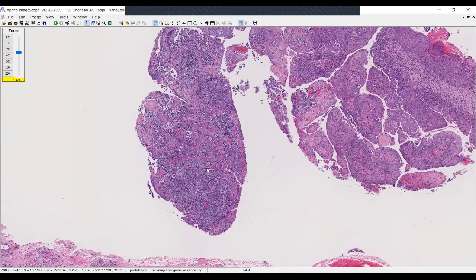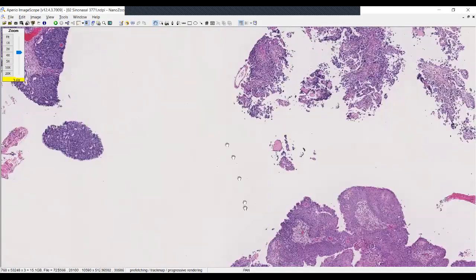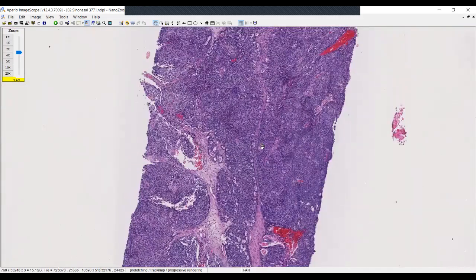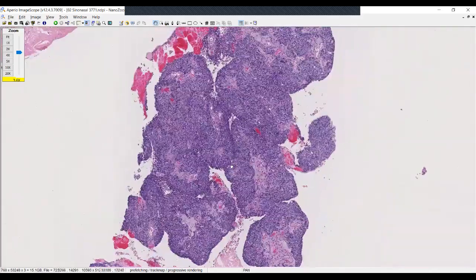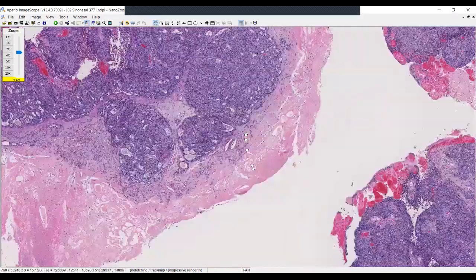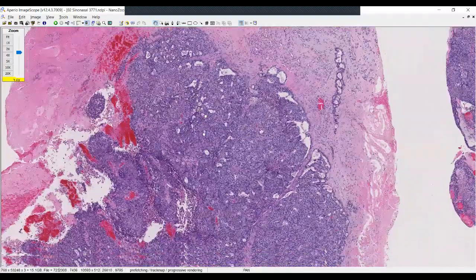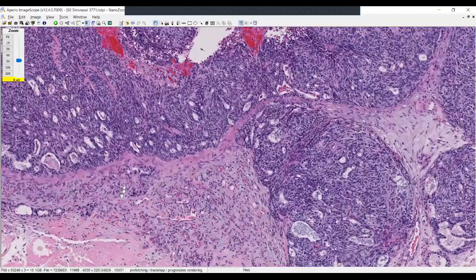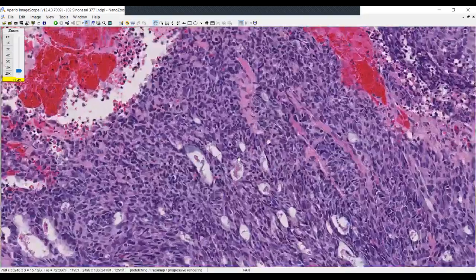So already my index of suspicion that something else is going on has been elevated by seeing these two areas juxtaposed next to each other. However, now as you go up into the rest of this proliferation, I think that you can see that there are multiple fragments of material present here. They have a fairly proliferative appearance to them. When you go to now begin to examine them on higher power, I think you can see that there is quite a bit of remarkable and profound pleomorphism.